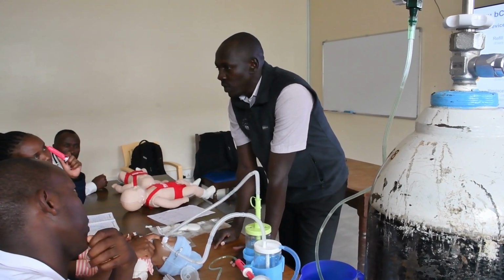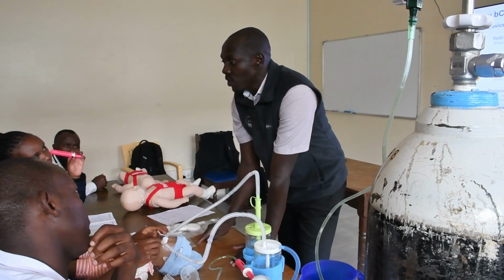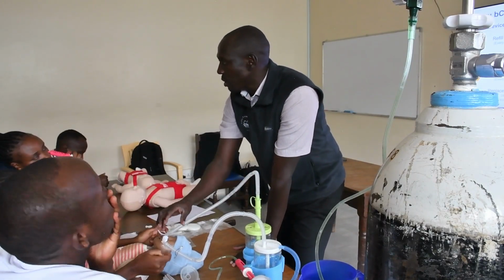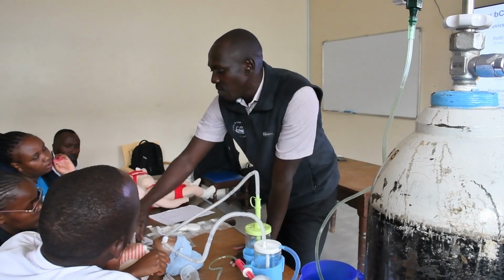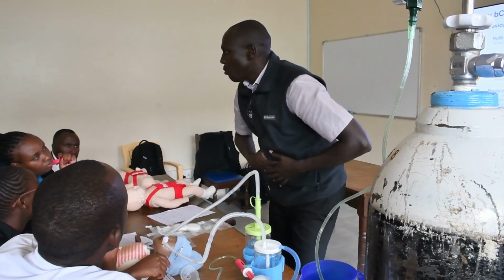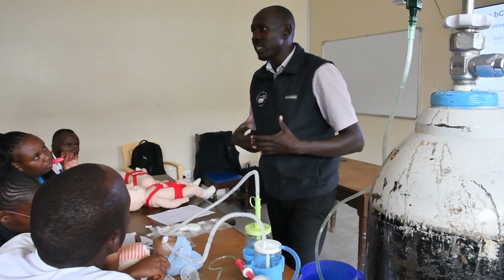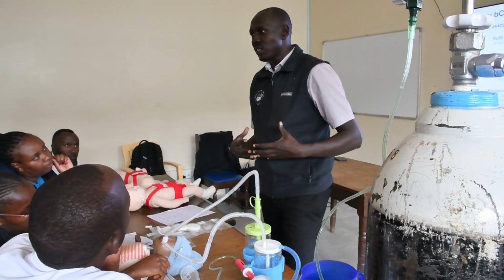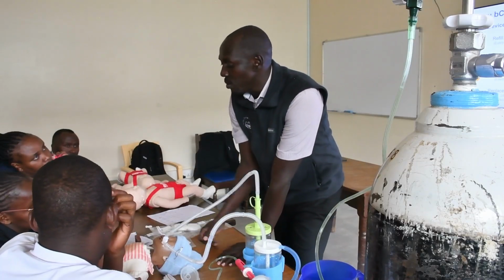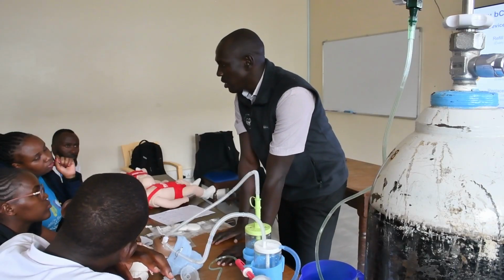What else do you put the OGT for? Put the OGT for feeding and for? To decompress the stomach. Because some of the air is going to the lung, some of it is going to the stomach. If you don't put an OGT, the stomach will be distended. Once the stomach is distended, it compromises the breathing muscles. Yes, it will compromise the diaphragm. So the baby will not be breathing properly. So put an OGT, it will decompress the stomach.